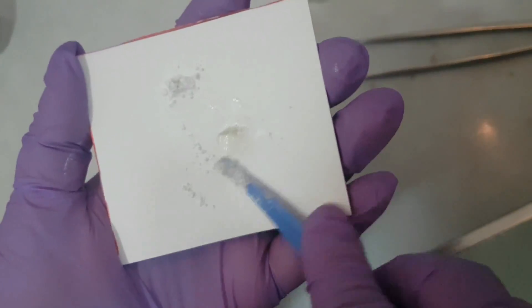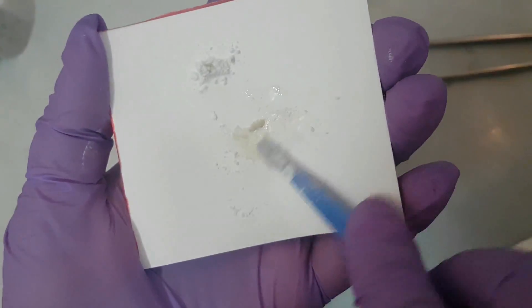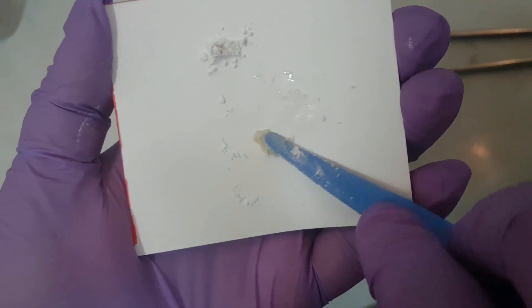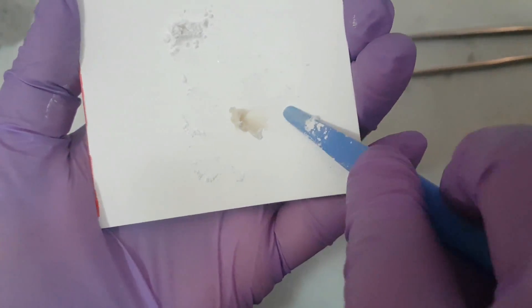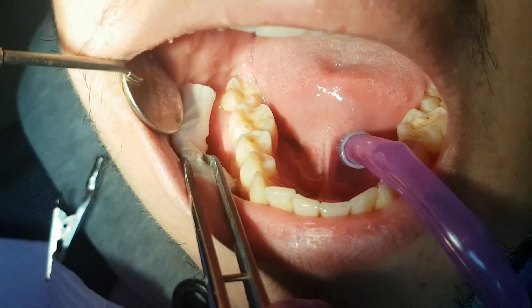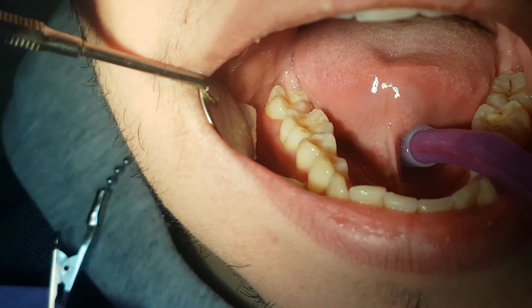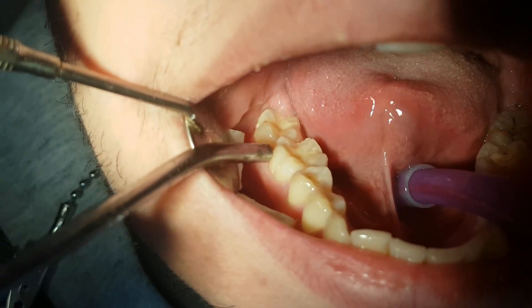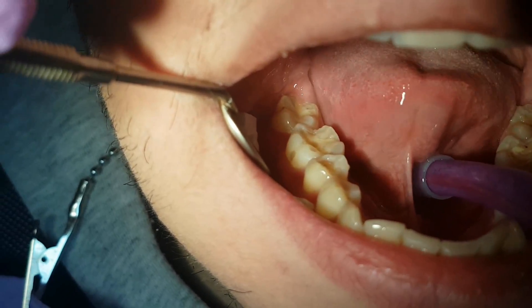These materials belong in the group of adhesive components. We need a dry working area, so we use a tampon to dry the cavity.